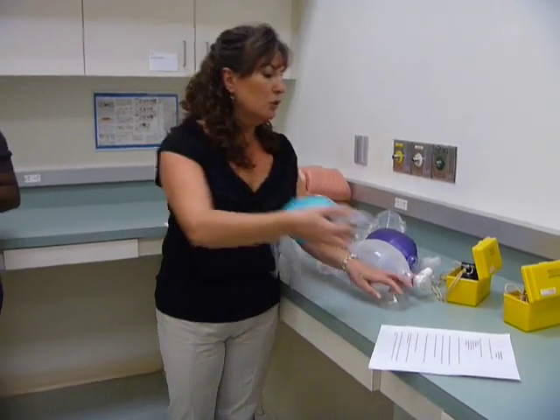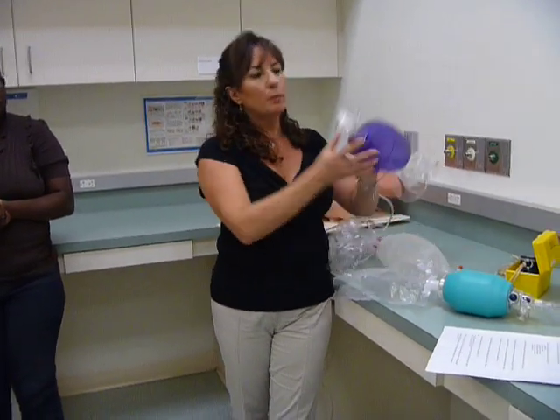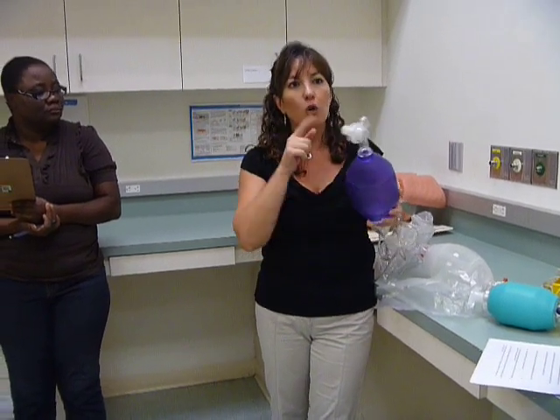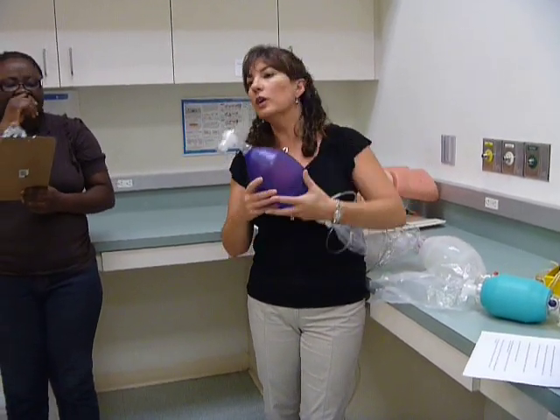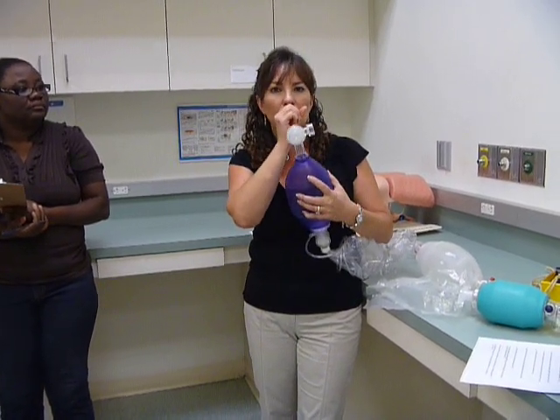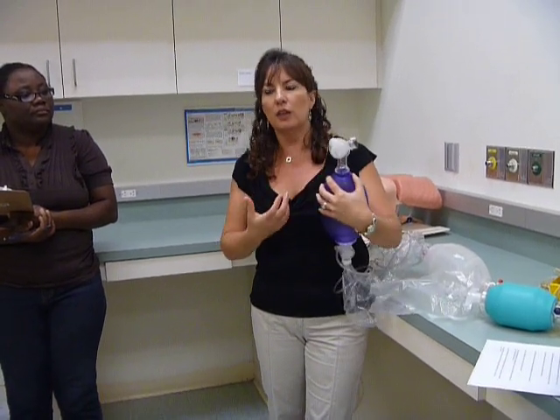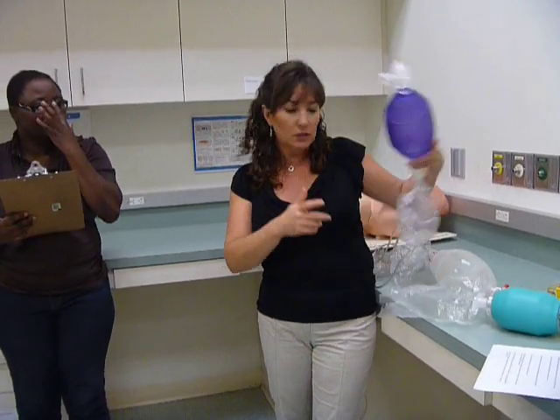Next, I'm going to give you a filter and you're going to put it on the resuscitator bag and take a breath in. Tell me — does taking a spontaneous breath in open the valve? The only way you'll know is to actually use a filter, put it on here, and take a breath in through the filter. We know the valve opens when I squeeze it, but what if the patient is trying to take a breath? Will the valve open and let them take oxygen or not? You'll have to see if that works.